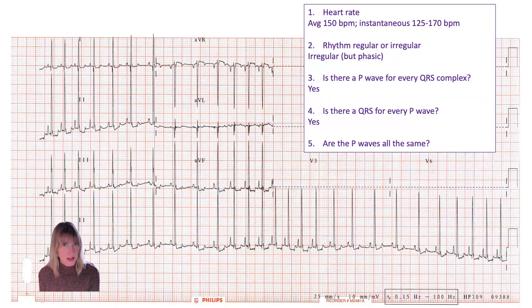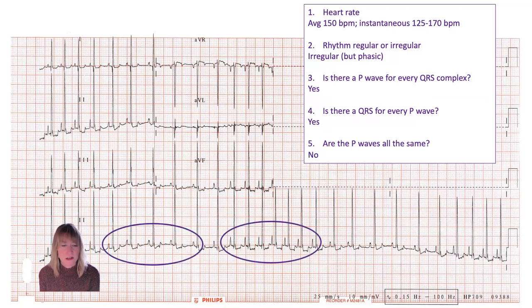As to whether all the P waves are the same, that's where things get interesting. They're not all the same, and I've identified two populations here. We have some that look smaller or shorter, and others that look taller, so there's definitely two populations here. I'm already starting to think, is that because they're arising from different locations, or are they perhaps taking a different pathway through the atria, or a bit of both?